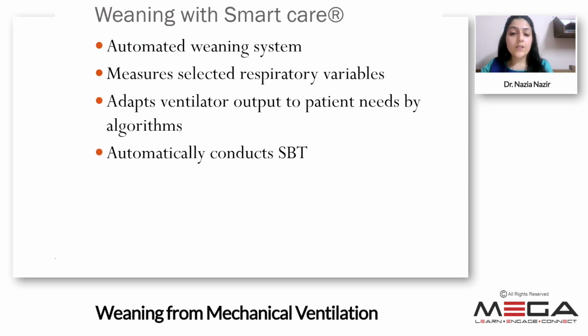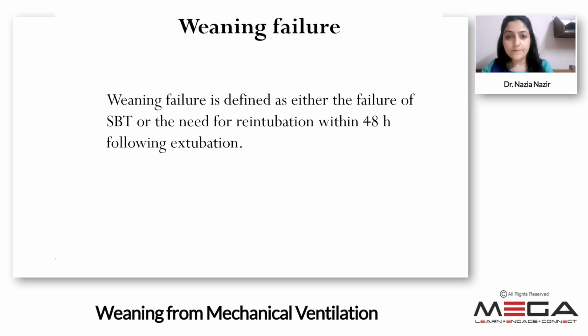However, an RCT which was conducted did not show an advantage of these SmartCare weaning methods over the protocolized weaning. So the physician has to be aware of these weaning modes, and only then go for these newer weaning methods. Now, what is weaning failure?